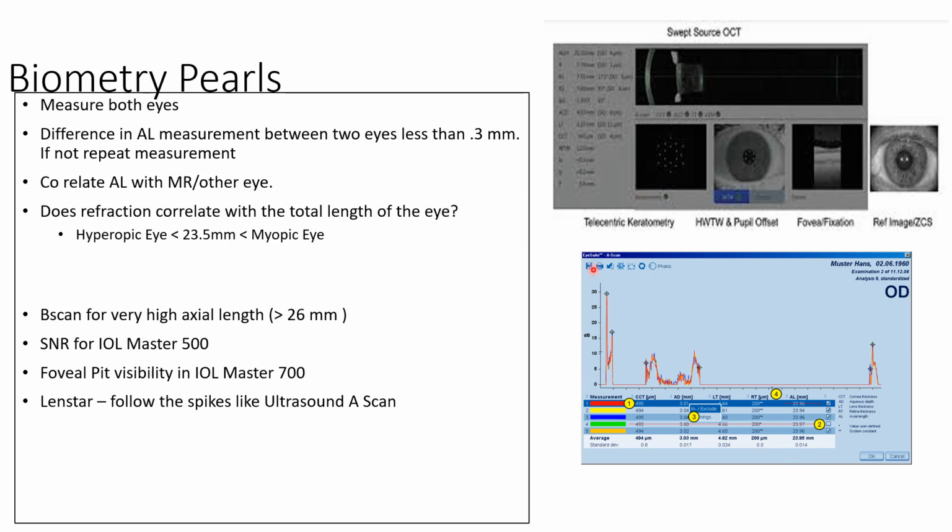In the LenStar, you can also correlate with the spikes, like what we do in an ultrasound A scan. So in the LenStar, you will also find the spikes here, and you can correlate them.